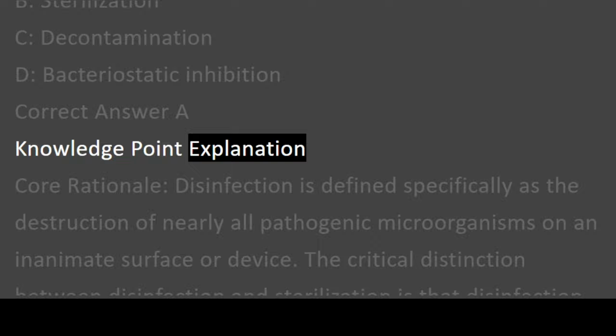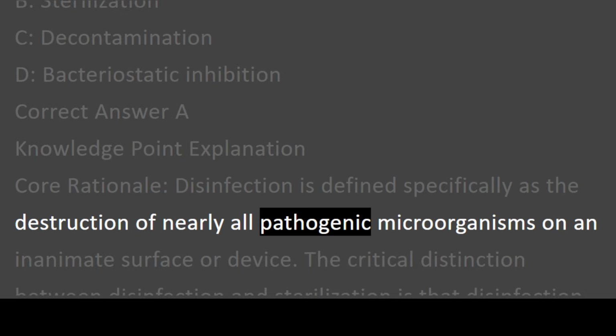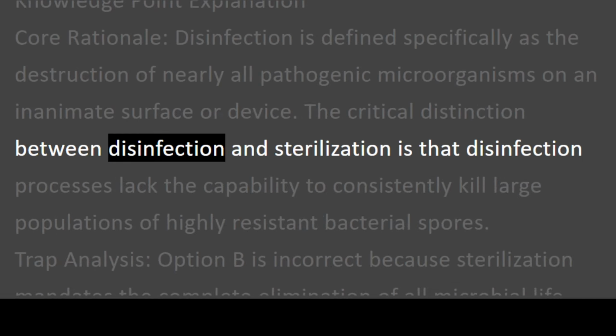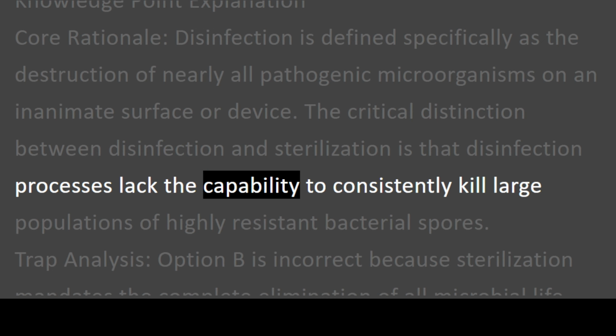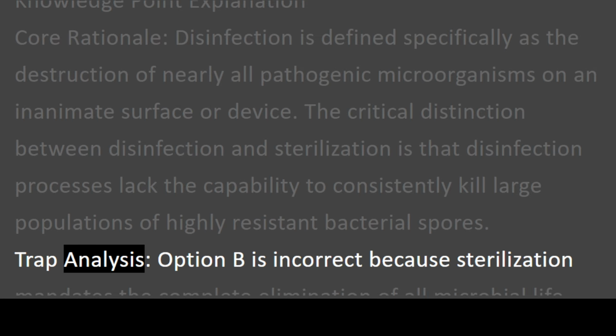Knowledge point explanation. Core rationale. Disinfection is defined specifically as the destruction of nearly all pathogenic microorganisms on an inanimate surface or device. The critical distinction between disinfection and sterilization is that disinfection processes lack the capability to consistently kill large populations of highly resistant bacterial spores.